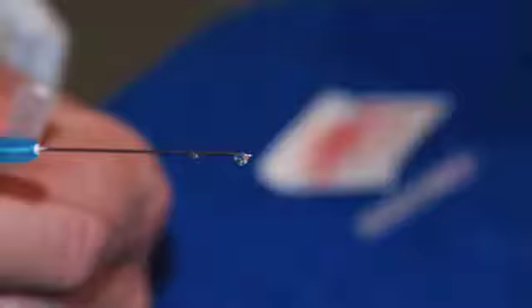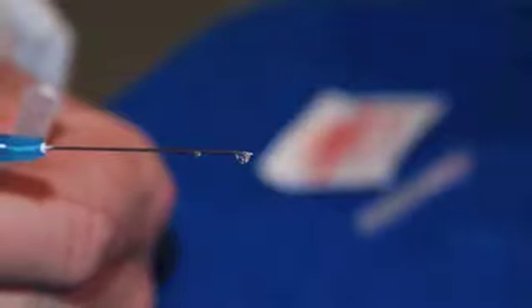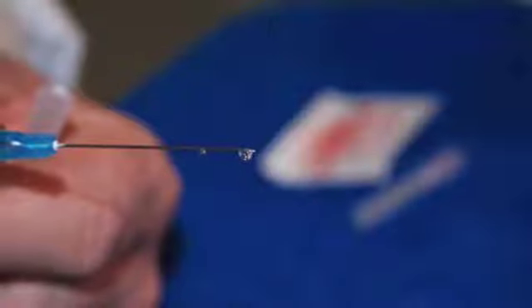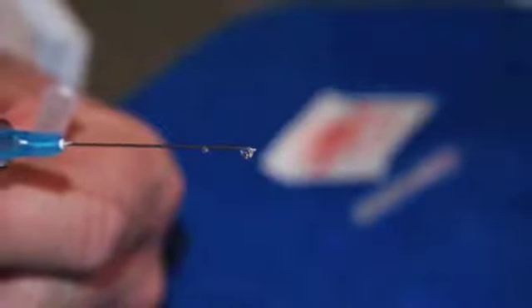What you're going to want to do is press down on the plunger very, very slowly till you just begin to see a drop at the end of the needle. There it is. That serves as a fantastic lubricant and aids the needle entering through the skin. You'll really want it hanging off the tip of the needle, not down the shank as we have here. This is really how it should look, with just a single drop hanging at the tip of the needle. This will greatly aid your injection and decrease pain.